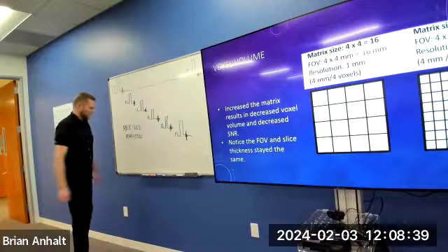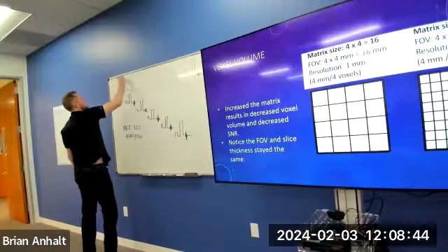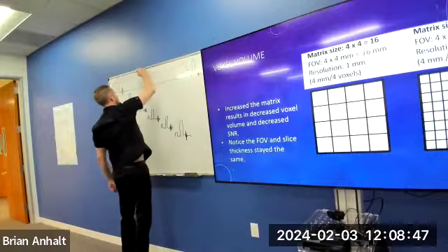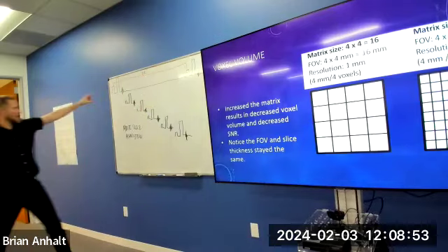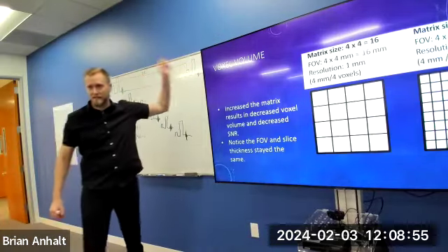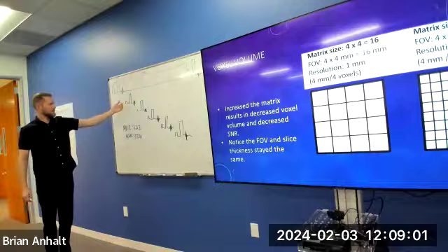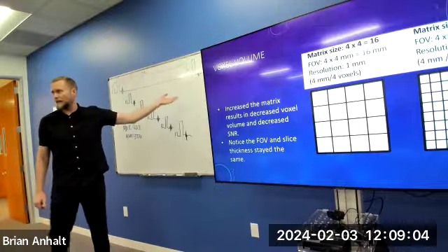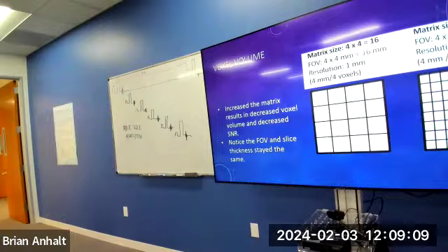Right, so right here is our TR, correct, from here to here is our TR. And all these slices have that TR, but we have time in between, waiting after we collect this echo until we have to go back and excite the next slice again. So in this case, we have time to collect data for slice 2, 3, 4, 5, 6 until we have to go back. So with this TR, whatever it is, and the TE that's prescribed, we can collect 6 slices, right? So keeping this in mind, there's another trade-off involved with your TR.